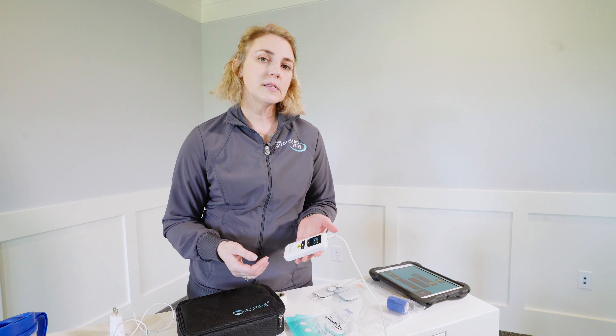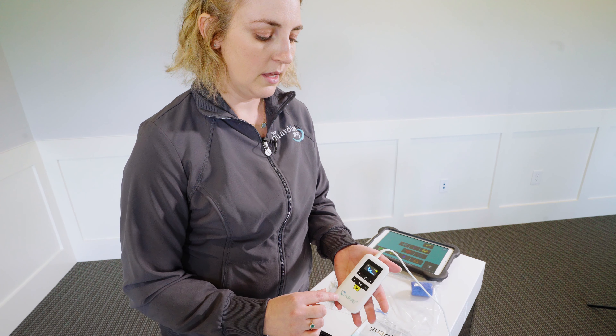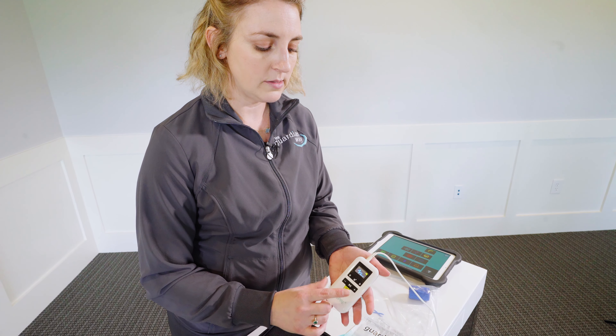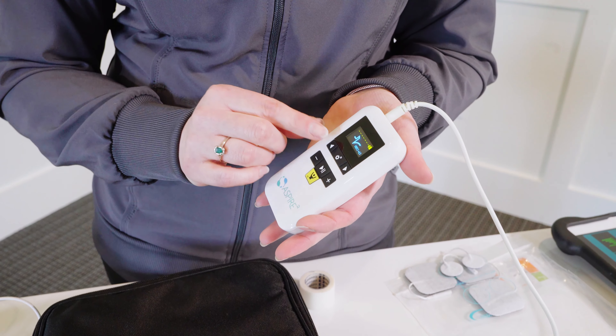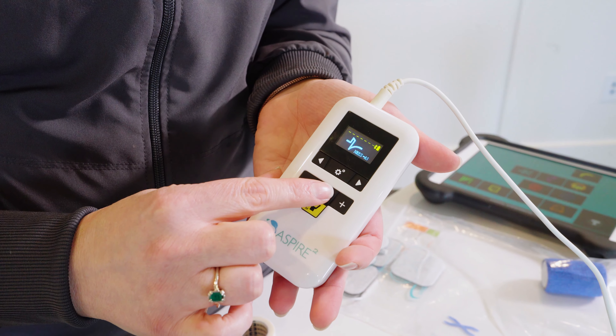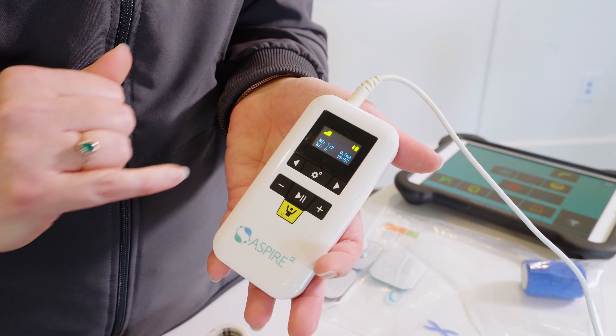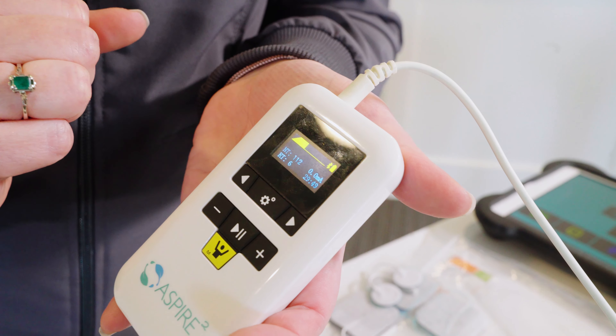Next, we're going to look at how easy it is to switch between modes on your Aspire 2. To go from Surface EMG to NMES or e-STEM, you'll simply hit the yellow button at the bottom of the device. You can go through all the different options and stop on NMES. You'll then use the triangles on either side under the screen to go between different programs. When you're on your program, hit the play button. You'll see a waveform traveling across the top of the screen and the total time will start to count down. You'll need to slowly increase the amplitude or milliamps to get the signal going to the patient.